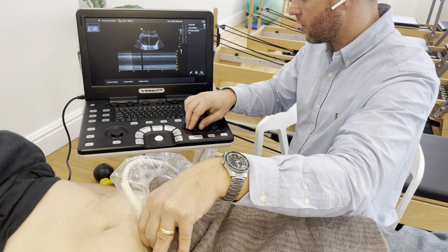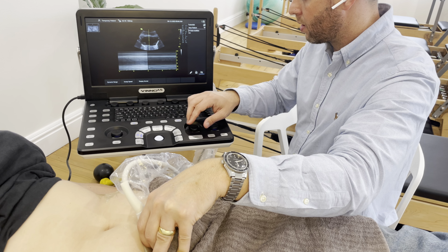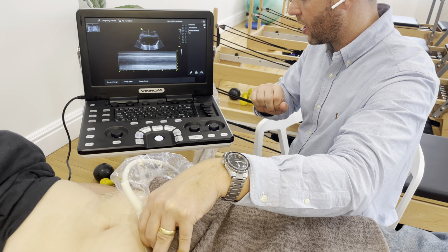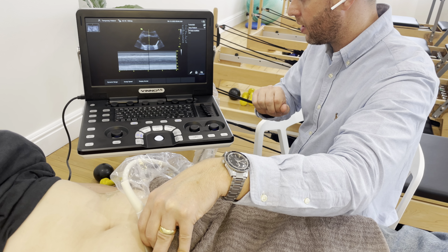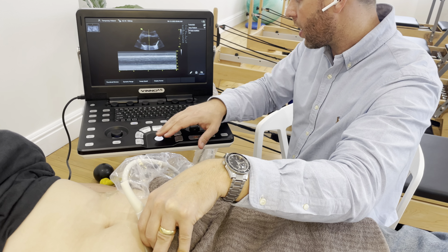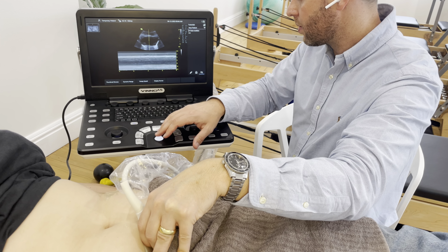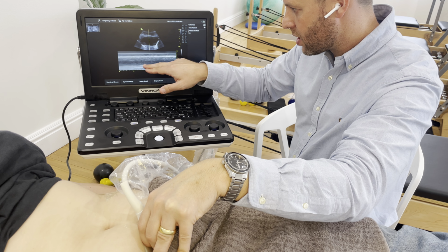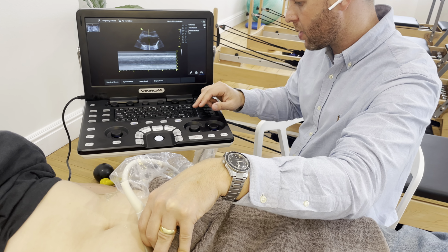So in a moment, not just yet, but whenever you're ready, could I get you to do a pelvic floor contraction for me? Now we're just keeping an eye and relax. So I'm keeping an eye on that last bit of the movement there. And what I can see is this little change in distance, this very, very small pelvic floor contraction.